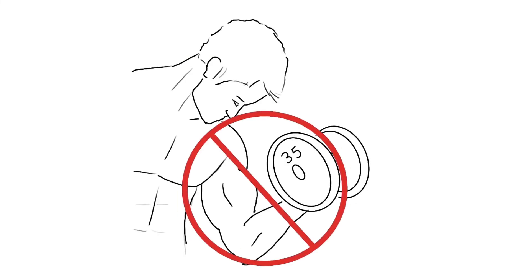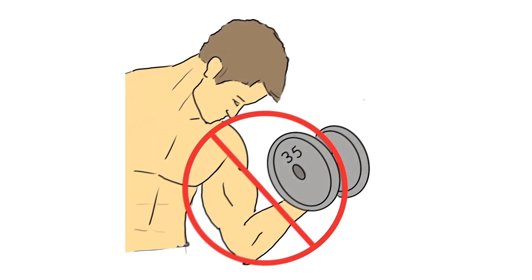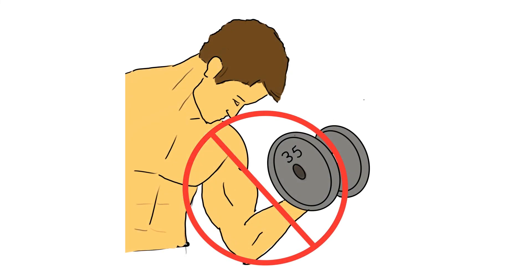Avoid strenuous exercise and heavy lifting with the arm that the blood was collected from for a couple of hours after the procedure. Do not hesitate to ask the laboratory professional any questions you may have before and after your specimen is collected.